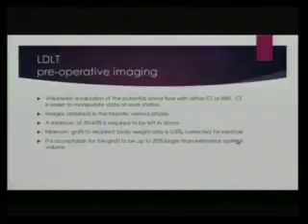Okay, so then we get to volumetric evaluation of the potential donor liver, and you can do that with either CT or MRI. It's way easier to manipulate the data at a workstation on CT, or if you have fancy software with your MRI, then you can do it that way. Basically, the choice is going to come down to which one of your big pieces of equipment has that software, because otherwise it's going to be very time-consuming and excruciatingly painful.